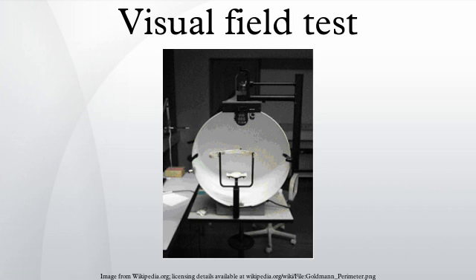This procedure is then repeated at several other locations, until the entire visual field is tested. Threshold static perimetry is generally done using automated equipment. It is used for rapid screening and follow-up of diseases involving deficits such as scotomas, loss of peripheral vision and more subtle vision loss. Perimetry testing is important in the screening, diagnosing, and monitoring of various eye, retinal, optic nerve and brain disorders.